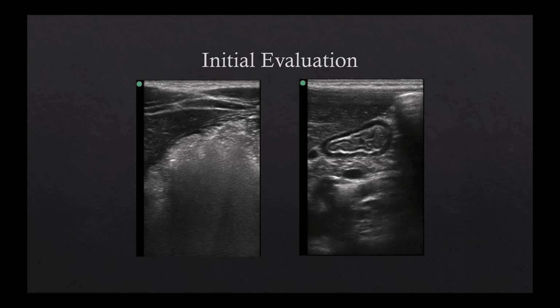In contrast, if instead we were to get this upon our evaluation, here we would see an enlarged antrum that has hyperechoic and heterogeneous content suggestive of solid material, which within our algorithm would point to this patient being high risk for aspiration. You could then integrate this information into the plan for anesthesia, be that both the timing of when to proceed as well as which airway and induction techniques to proceed with.